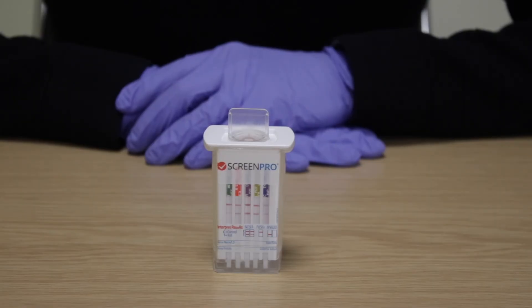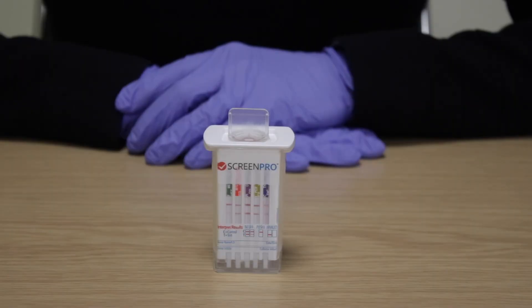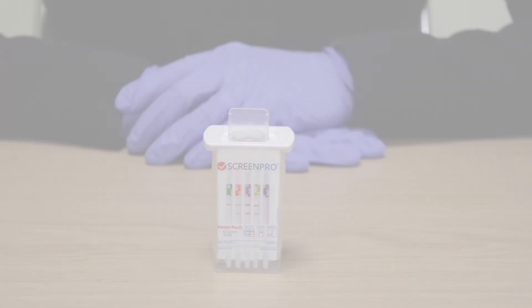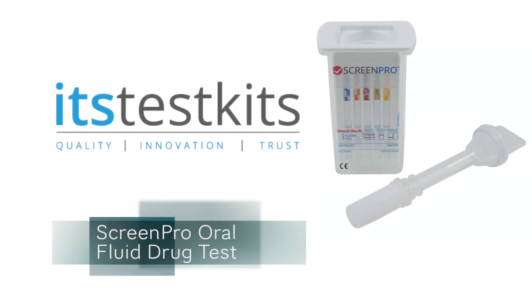If the device includes alcohol, read the alcohol strip at 2 minutes. Compare the colour of the reaction pad with the colour chart provided to determine the relative blood alcohol level. No colour change indicates a negative result. This concludes the ScreenPro Oral Fluid Drug Test Product and User Guide.